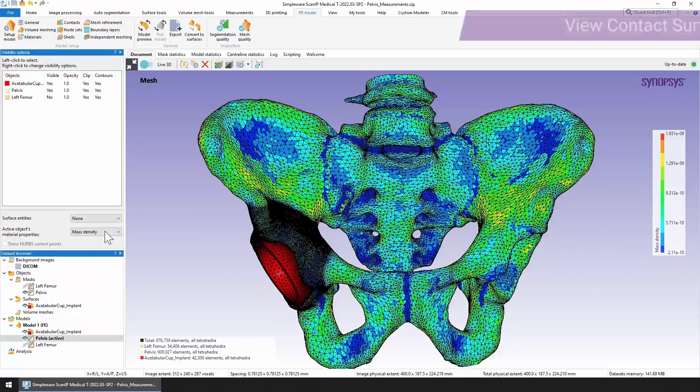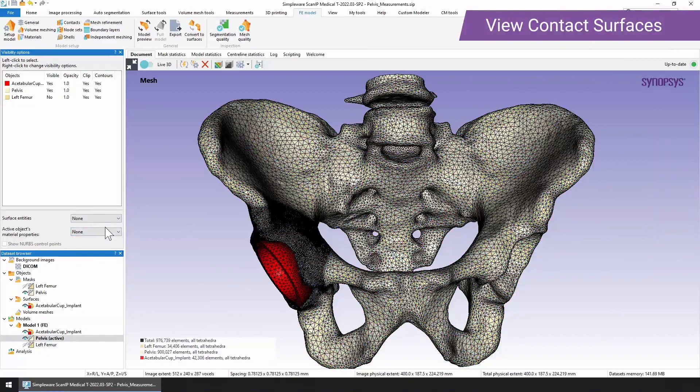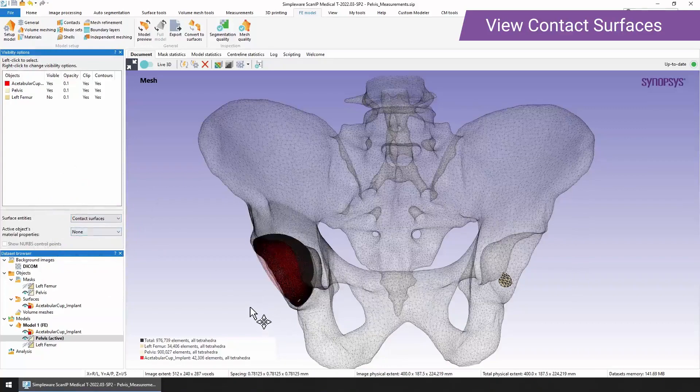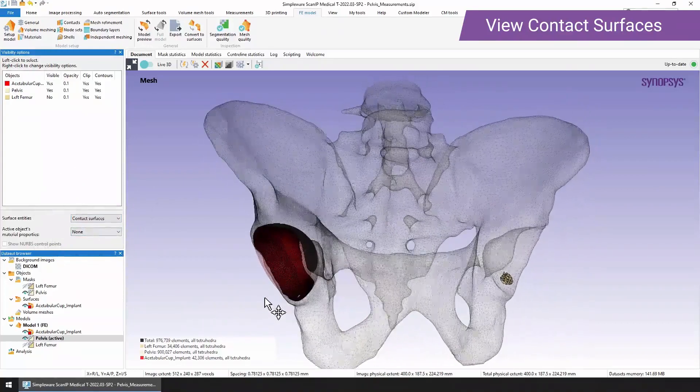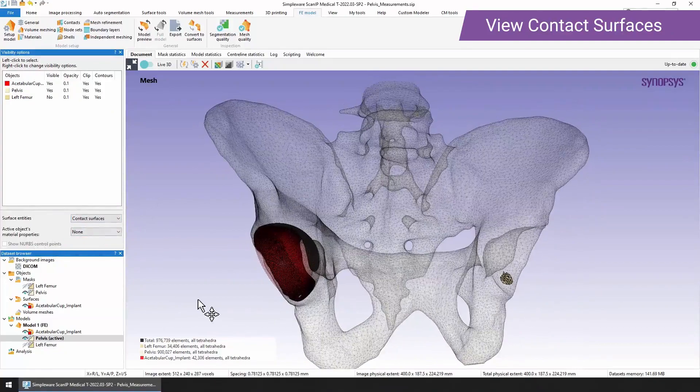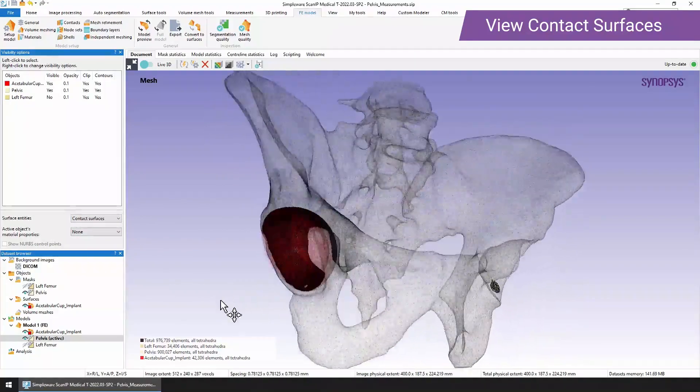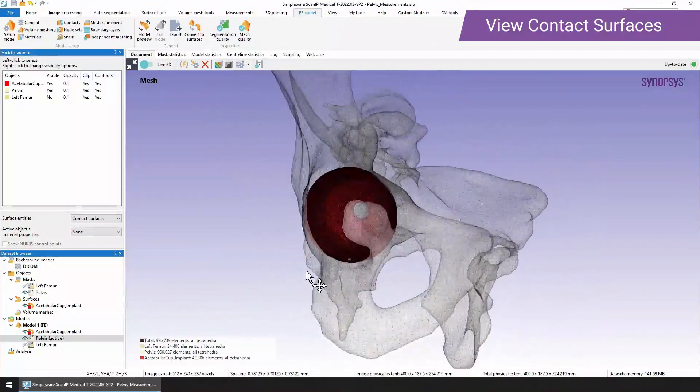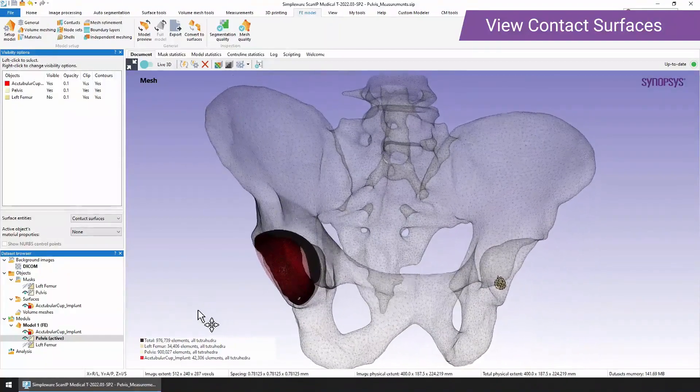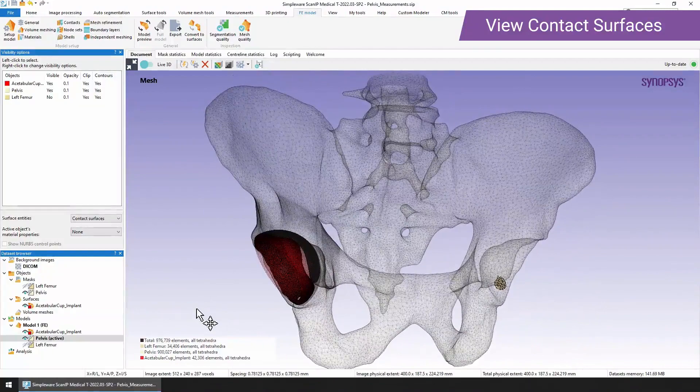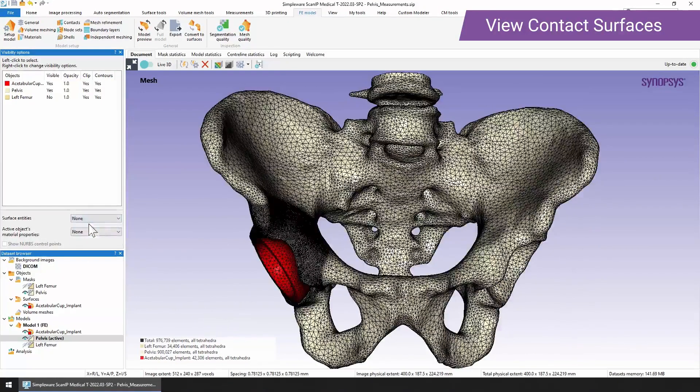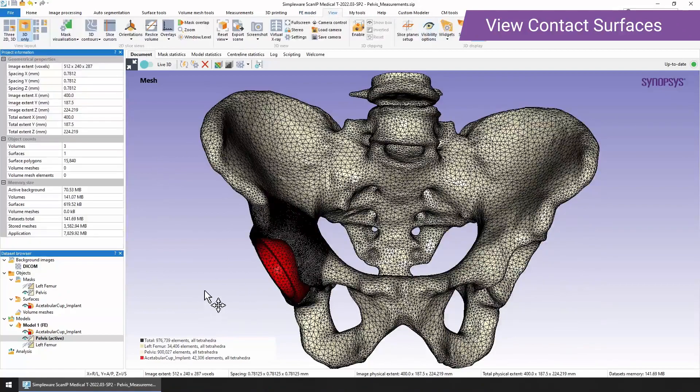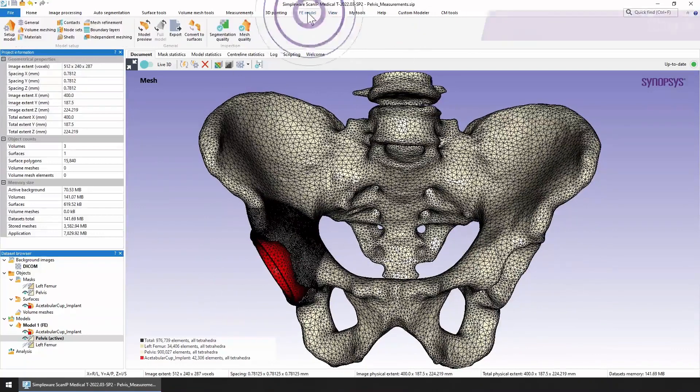The other thing that we had set up was contact surfaces between the parts. Here you can see the contact surfaces, just a small area between the left femur and the pelvis. And here you can see the acetabular cup has a much larger area. So those are the areas that are in contact. Those can be really helpful when you go into your simulation software. We'll just turn those off there, and then we can go back and turn the visibility options off.